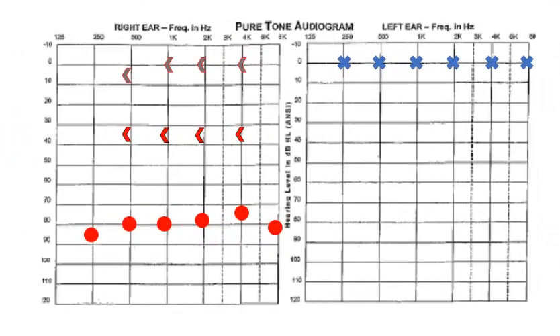A criticism might be, since the 1000 Hz bone conduction threshold of 0 dB is unmasked, then 80 dB might not be the actual attenuation value. If you mask the bone conduction on the right ear and it showed up as 35 dB, would that make a SIT-IA value of 45 dB? And if it was 45 dB, then 70 dB of masking noise would be too loud and cause overmasking. The answer is no. 80 dB is still the situational attenuation value.